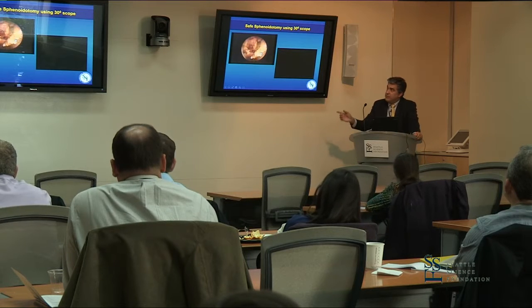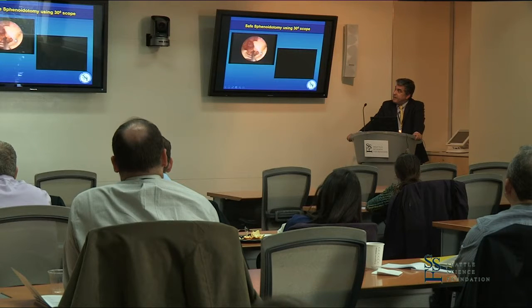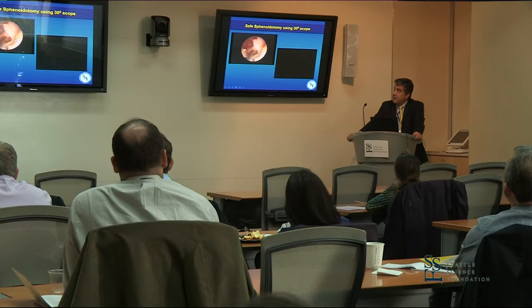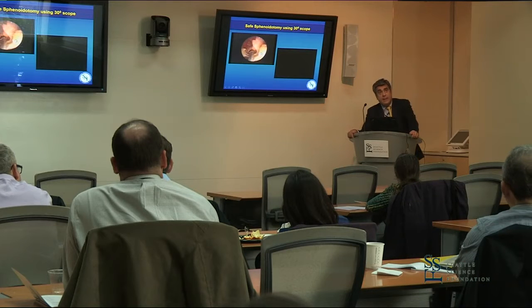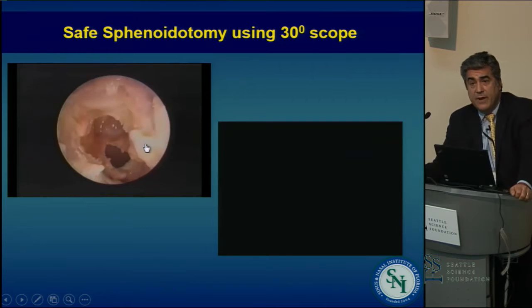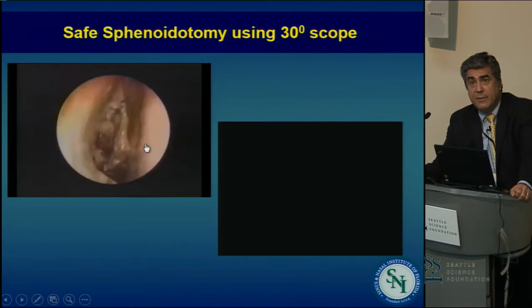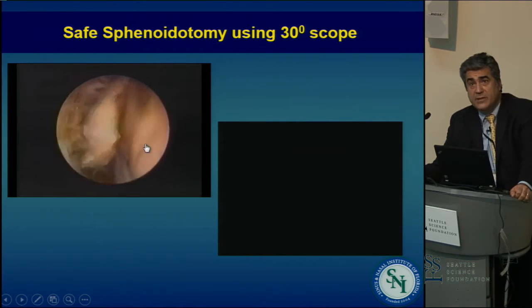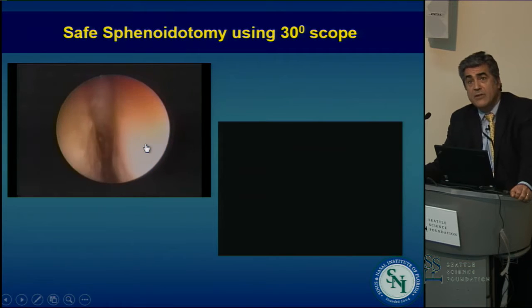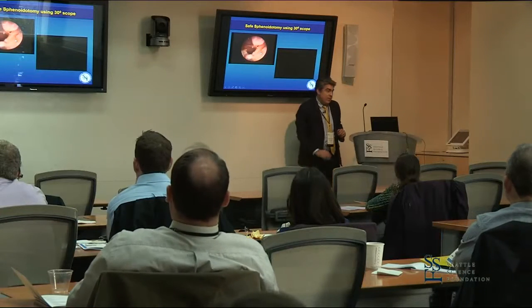So the sphenoid — I'm going to conclude in just a minute or two. I'm trying to show you how the opening gets made. This video was made almost with no edits; there were some quick cuts but it really did not take very long. We didn't have much time with the cadaver — it was after a visiting mini-fellow came and we had a specimen. You can see the superior turbinate, a lot of it is present, the concha lamella is up there, and the sphenoidotomy is widely open.